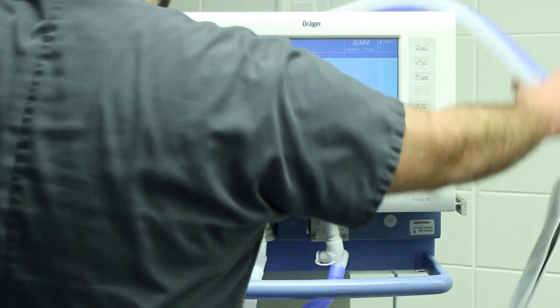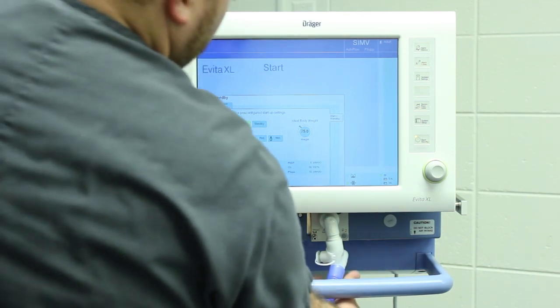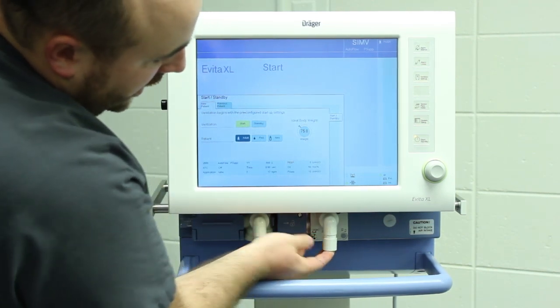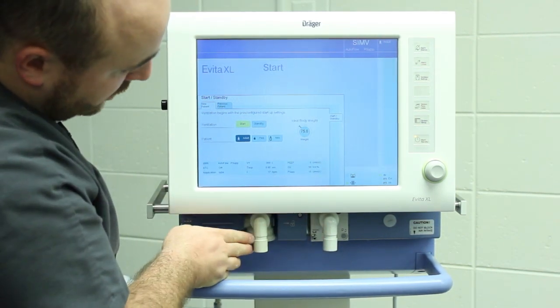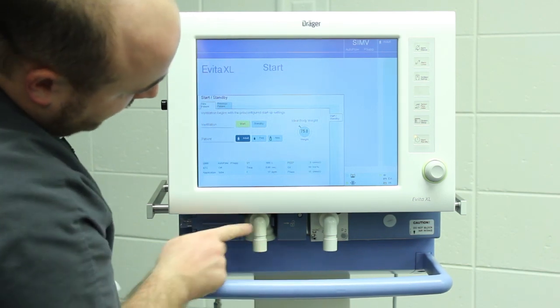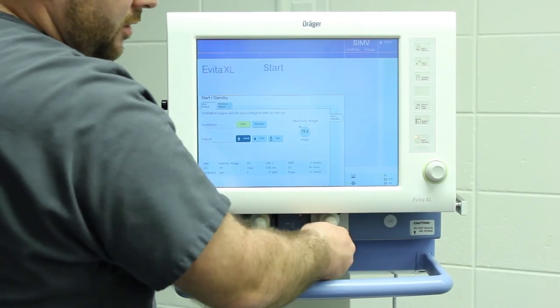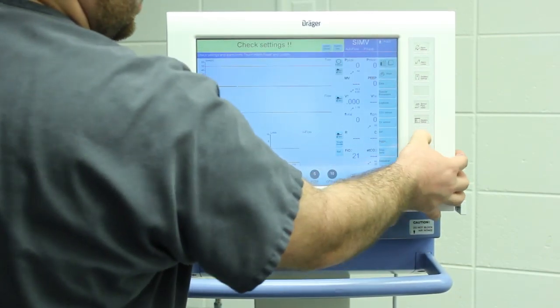I'm going to go through the circuit in case it comes undone or you have massive leaks or major issues. We have two sides: the inspiratory side — you can see the arrow going down right there — and the expiratory side, which goes back into the vent right there. The inspiratory side stays intact and does not come out; the expiratory side does.